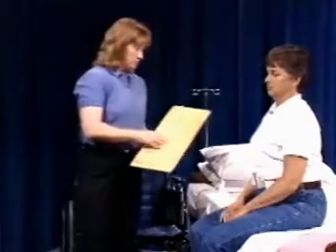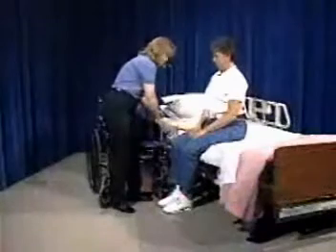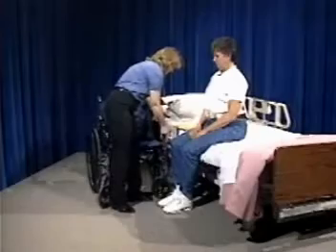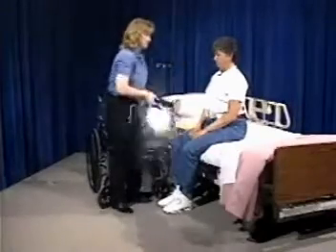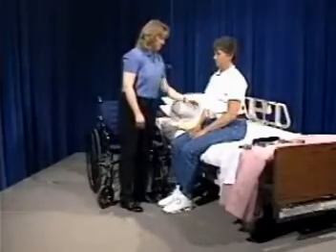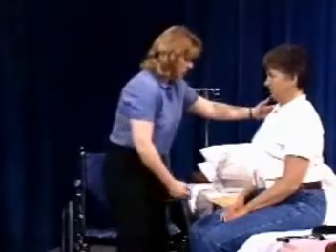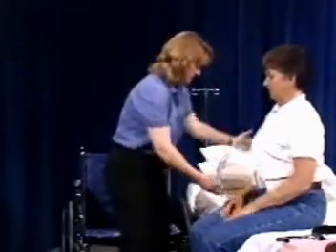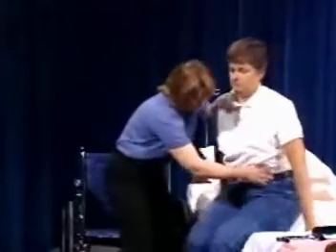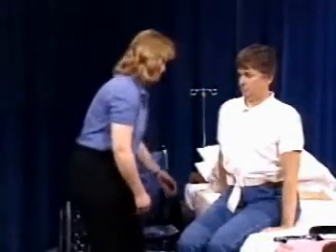When you use a sliding board, you need to make sure that you have a wheelchair that has removable armrests. And you want to make sure that you get that armrest closest to the patient removed prior to the transfer. Now I've already got the patient in a sitting position. I have a safety belt on her. And I'd like to ask my patient to just adjust herself a little bit so that she's scooted almost a quarter of a turn. So I'll get her in that position just to make the slide a little bit easier.